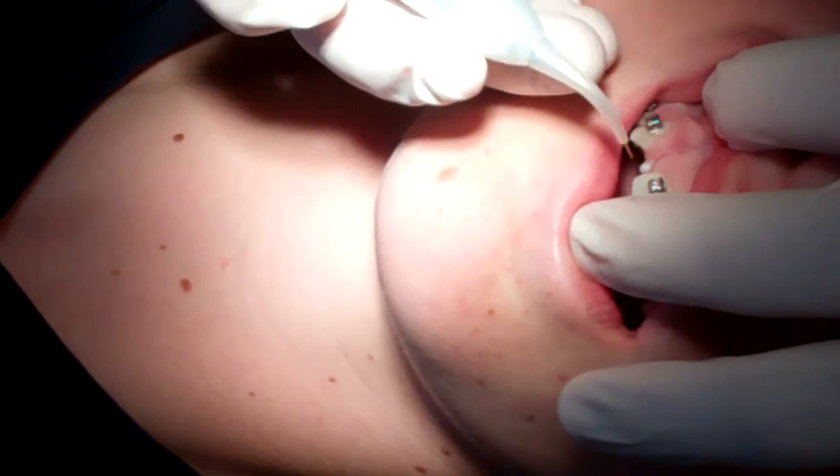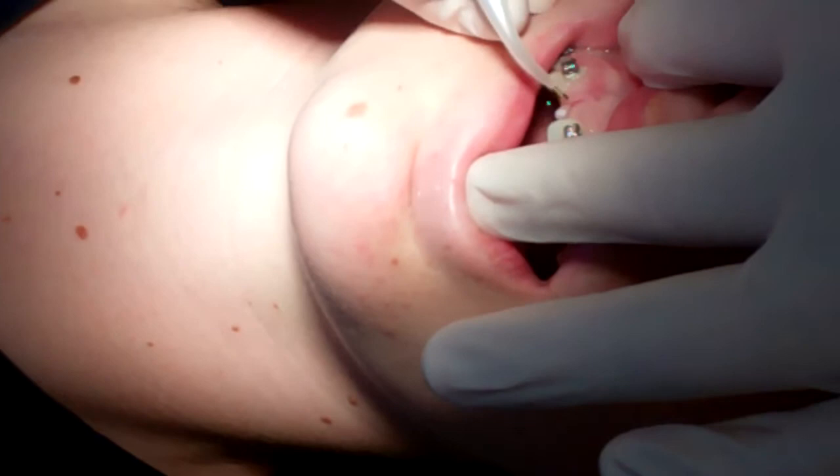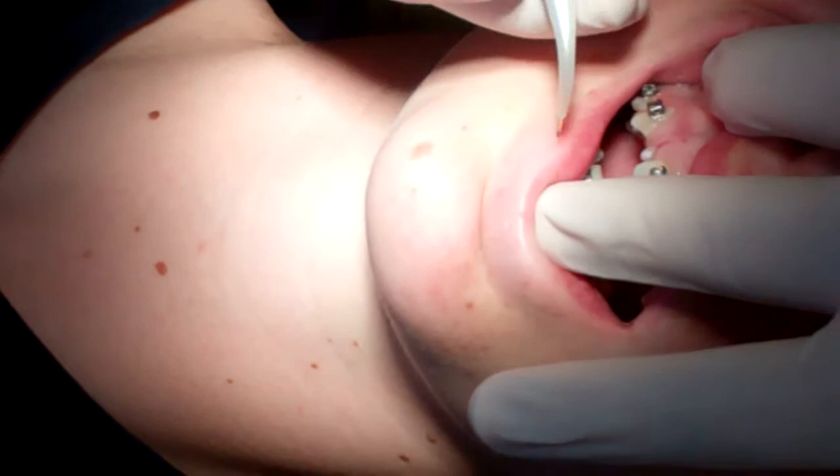This is the Stylo Ortho Laser. You can see on this lateral that the gum tissue is covering it, so we need to get a bracket in the right spot. We just remove a little tissue. We numb the gingival tissue up here so we can access this without causing the patient any discomfort. We've already tested to make sure the patient doesn't feel anything here, so we're good to go.